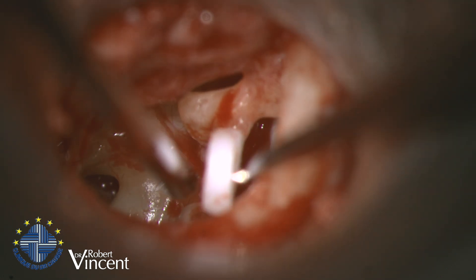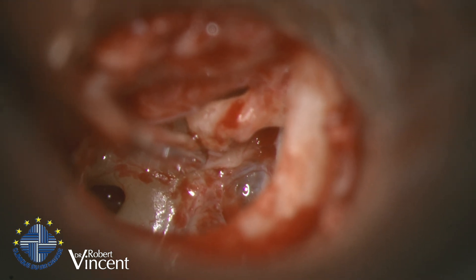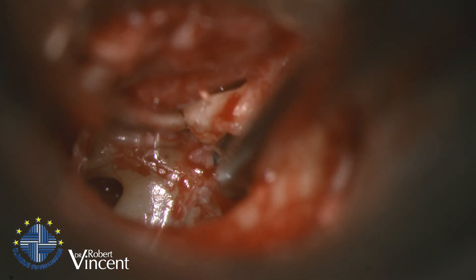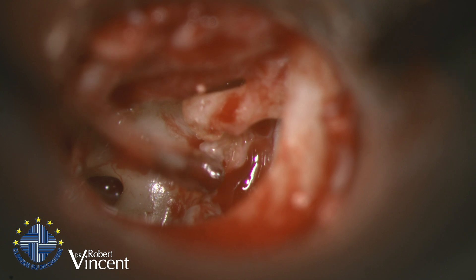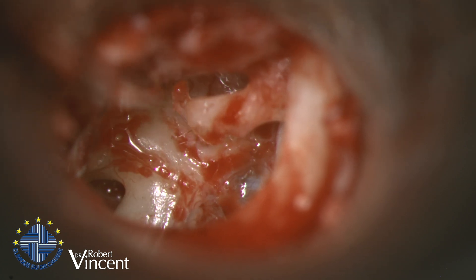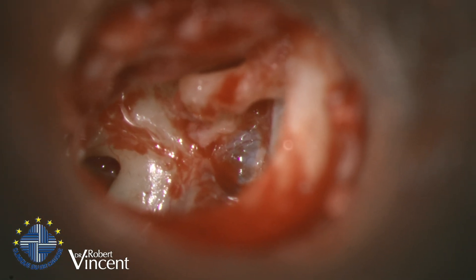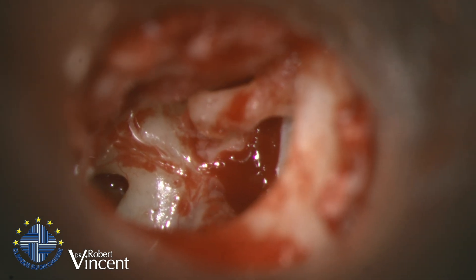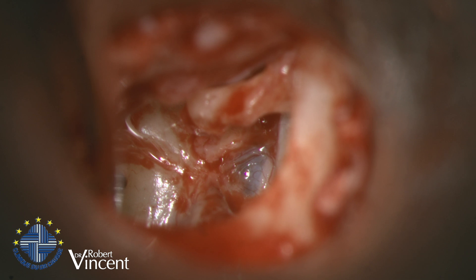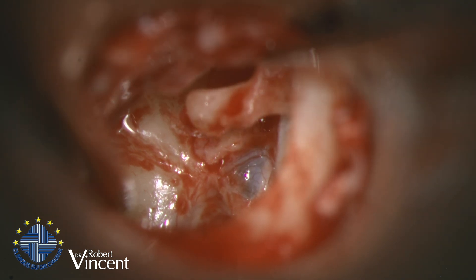There we go. Now it's bleeding, of course, because there is a lot of fibrous tissue — very thick tissue that was probably used for interposition. I don't want to remove that completely; I'll leave it. Now we have a nice exposure of the perilymphatic membrane, which I need to fenestrate — it's a bit like performing a stapedotomy on the footplate. Since it's bleeding, I'm going to use some adrenaline. I want to check again the mobility of the malleus and incus — it's fine.